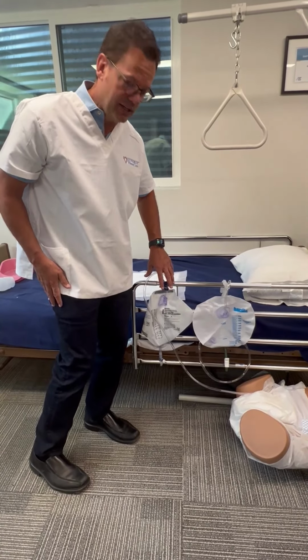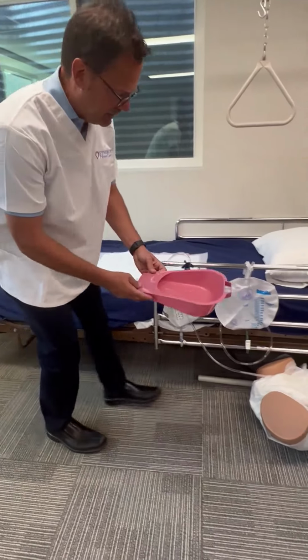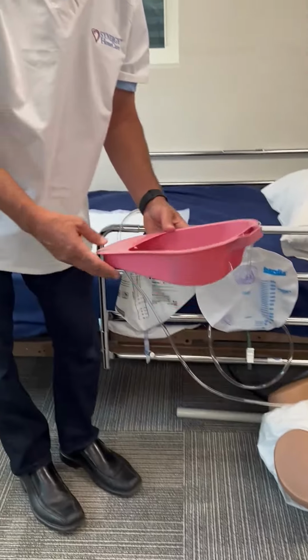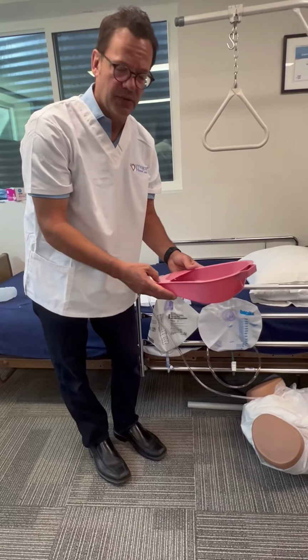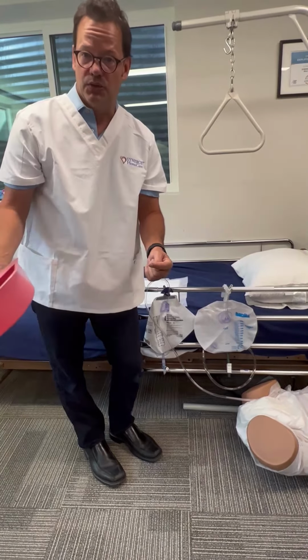How to drain it is just drain it. Sometimes we use a bedpan for that purpose. So we would drain the catheter bag into the bedpan. The bedpan would then be taken to the toilet. We always empty into the toilet. We might rinse from a sink or from a shower, and then empty always into a toilet.